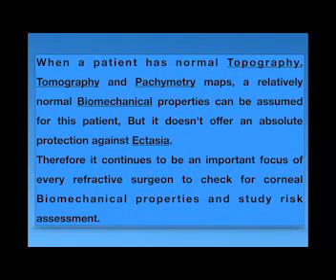So if you suspect any patient, if you have any mild risk, you have to send this patient to get ORA or Corvis to study the corneal biomechanical properties for this patient, which will support you.